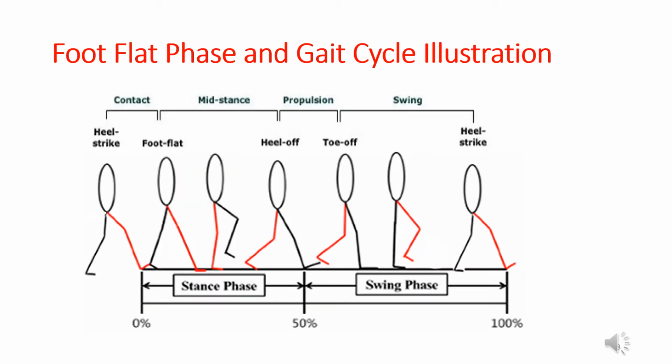The foot flat phase has an important function since body weight is transferred to the lead leg at this point and must absorb this weight while maintaining forward momentum. The step width, step length, and step speed: all these parameter calculations are based on this foot flat phase stage.